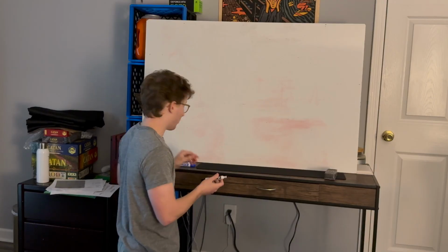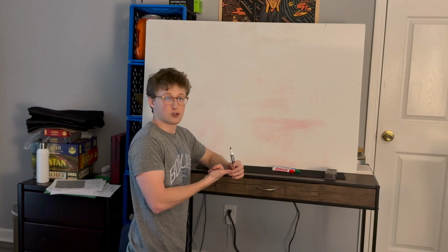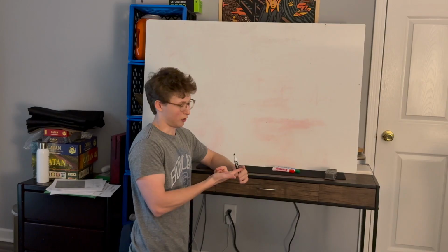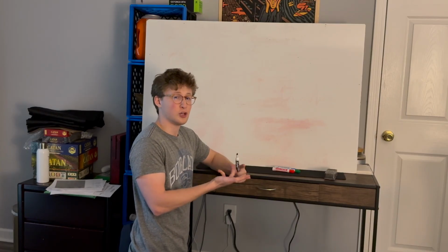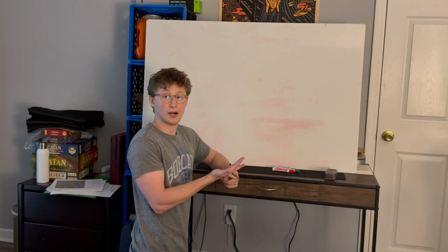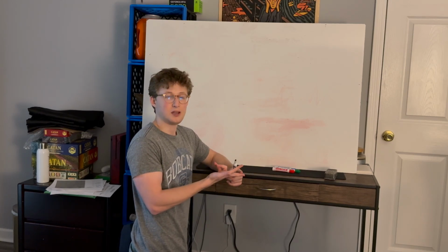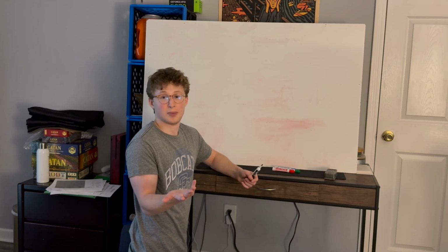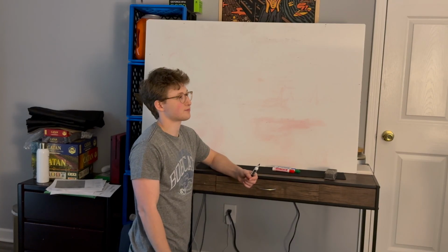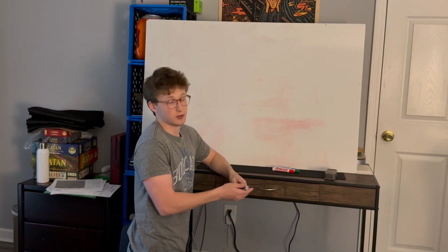Because it's really way more important, because arrhythmias change. There are so many variabilities in terms of what the ECG will look like. Patient size. Are they pregnant? Are they moving around? Are the ECG leads, electrodes placed in the right place? Was hair removed before they were placed? Was enough gel placed? Were they cleaned properly? Electrolyte imbalances. Noise, again, from movement.